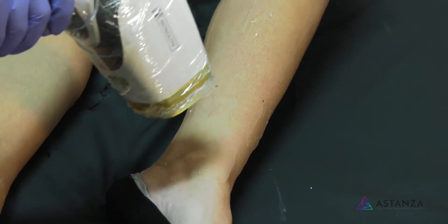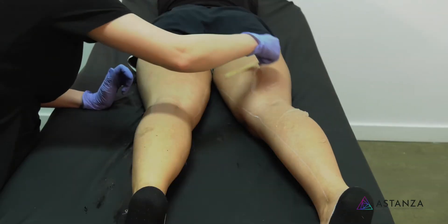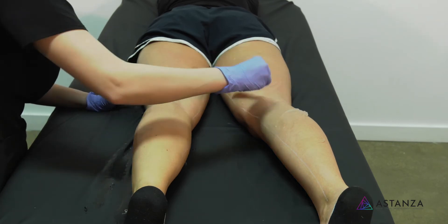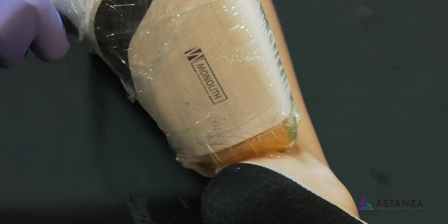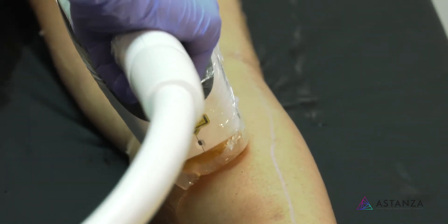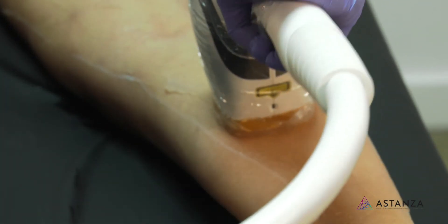The handpiece is really easy to maneuver considering how big the spot size is. Holly can't believe how painless it is. Since it's a square, you can turn it any which way. You don't have to worry about an orientation or a weird hot spot with this one either, because the handpiece is fully homogenized — so whatever comes out of that window is the same as anywhere else in that window. The handpiece is a little larger but pretty easy to use.